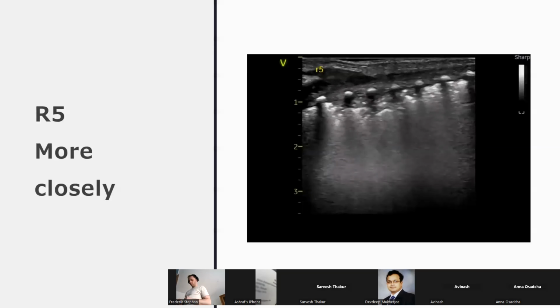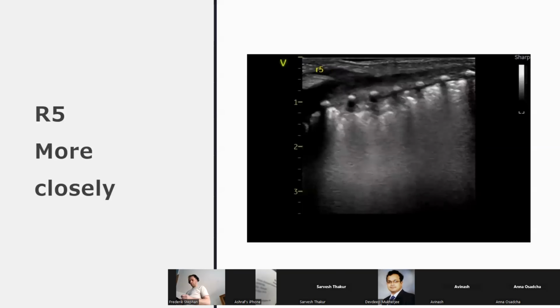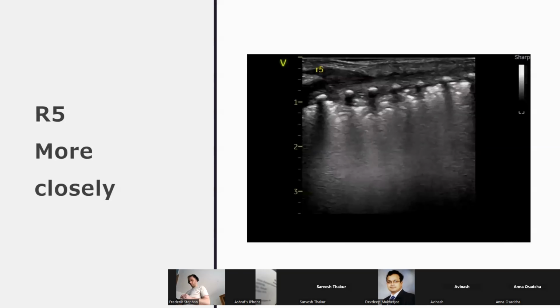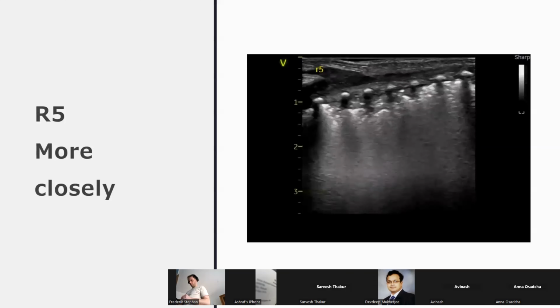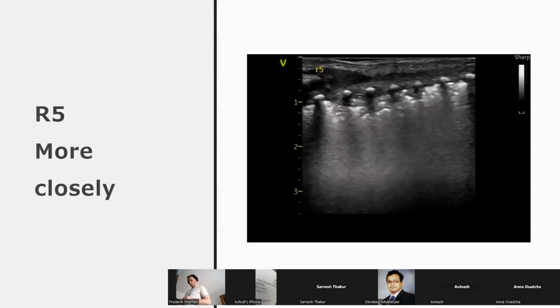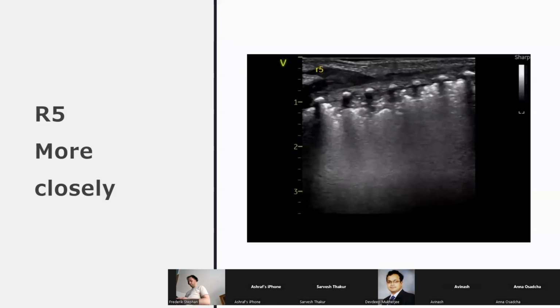I think the benefit of using lung ultrasound is the objectivity. A clinical recruitment maneuver is done in different ways. Some people, if the baby isn't saturating, will put the baby on an FiO2 of 100% and keep rapidly increasing pressure with PEEP every 30 seconds, going up by 6, or it's massive. You sometimes go from 6 to 12, and what you're really watching for is when the baby starts saturating and pulling down. It's really bad outcomes with that. So I've seen babies who recruit as well.